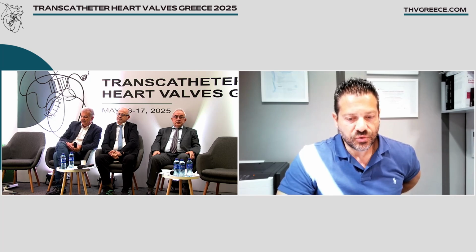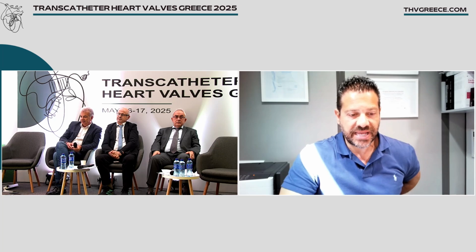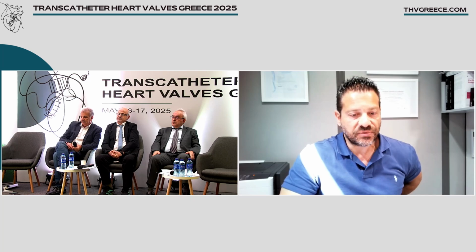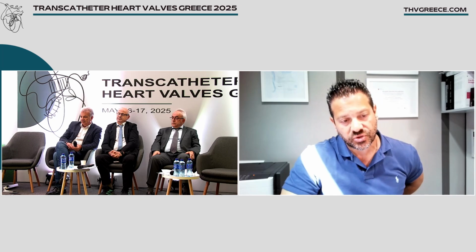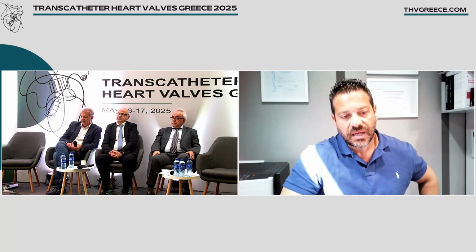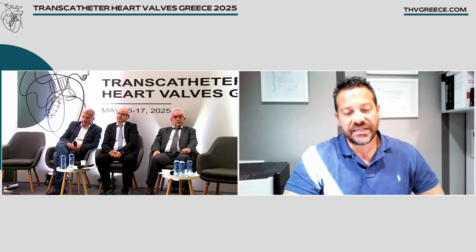Panos, thank you for your question. According to all papers that were published for 3D echo, ejection fraction correlates very well with CMR, with a variability of around 3 to 5% of ejection fraction, which is very low, you know better. But we still underestimate the volumes. So about function, I think we can be accurate with the 3D method. But for volumes, we still need the CMR.